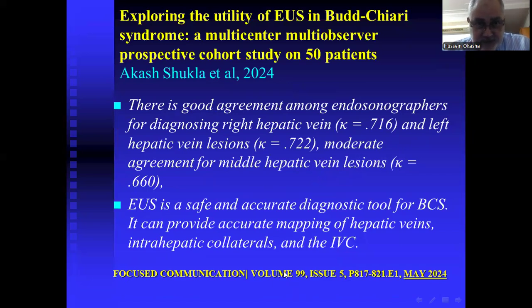This is my last slide. It is a very nice study in 2024 by Akash et al., who studied the utility of endoscopic ultrasound in Budd-Chiari syndrome, a multi-center, multi-observer prospective cohort study on 50 patients.